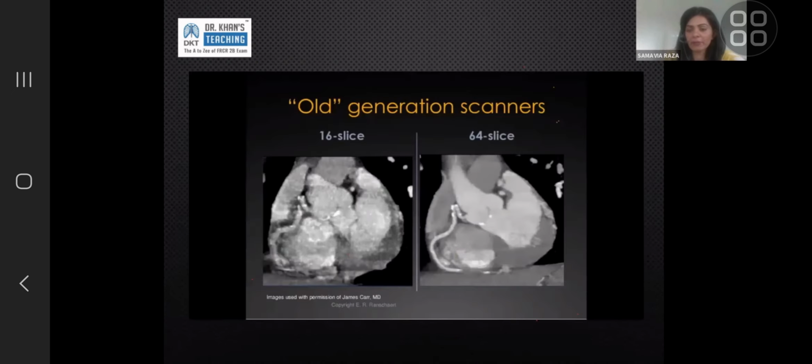Scanners have evolved rapidly over the last few decades. What you need to do cardiac imaging, the minimum requirement, is a 64 slice CT. And I do feel almost all scanners are now at least 64 slice. The higher the spec of the scanner, the better the cardiac imaging, because of better speed, better resolution, etc. On the older generation scanners, people did attempt cardiac imaging.